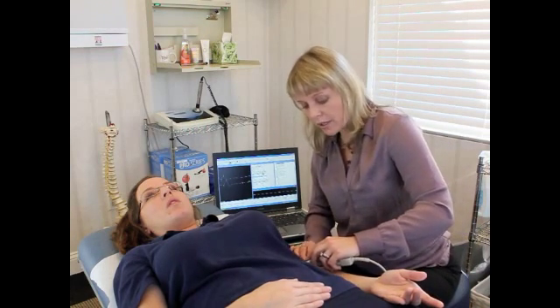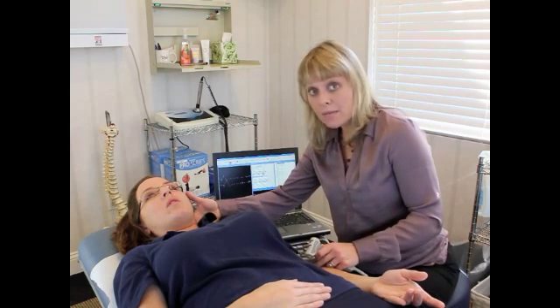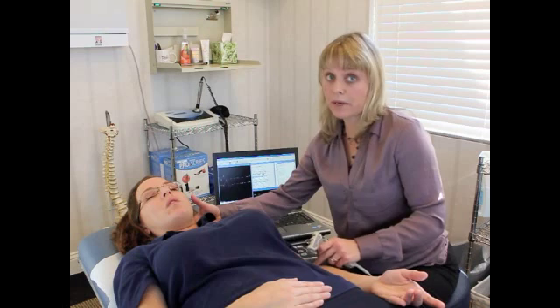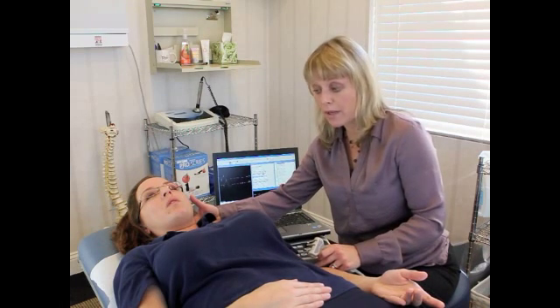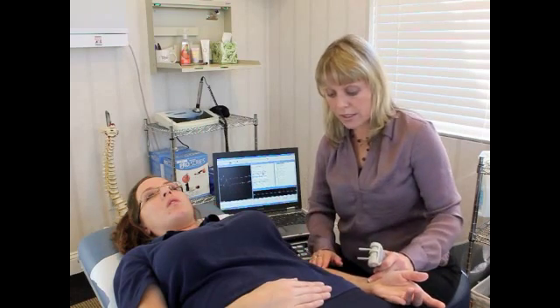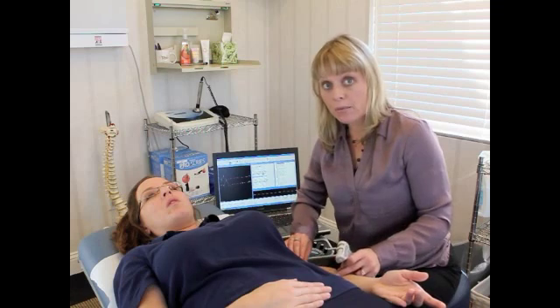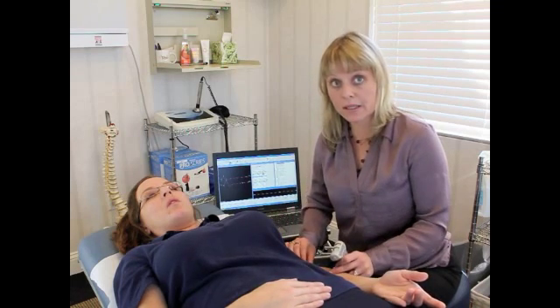And then we look up here because we want to see the speed as well. We also want to know maybe sometimes that is coming from your neck. You might already have an MRI result that we can compare that with. So we can see, is it talking to your brain here? Is there something else going on here? We also use EMG to see what's going on in the muscle, so we get that component as well. We can do the same thing in the leg.